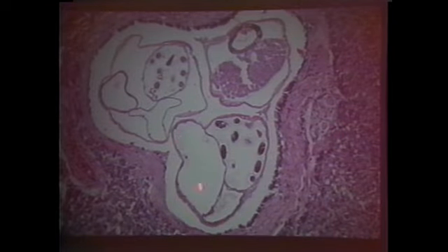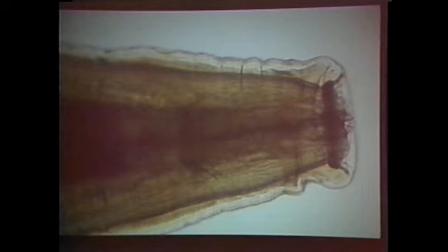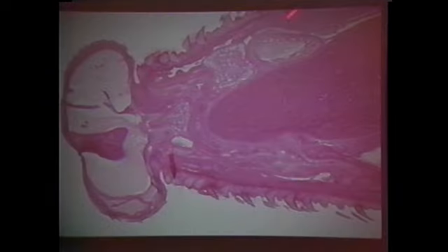This is Trichospirura. Most Trichospirura have very, very poorly developed musculature. But you can look inside and see those spirurid eggs, and you can tell it's a female by the number of genital tracts. Here's another section of a spirurid. Physaloptera, remember that anterior end? Y'all are all used to that, but you can see that in tissue section and use it. Gnathostoma, it's the only one with this big bulb and these spines. And here's a cross-section of it. Look, the coelomyarian musculature and the anterior end, it has these lateral alae.